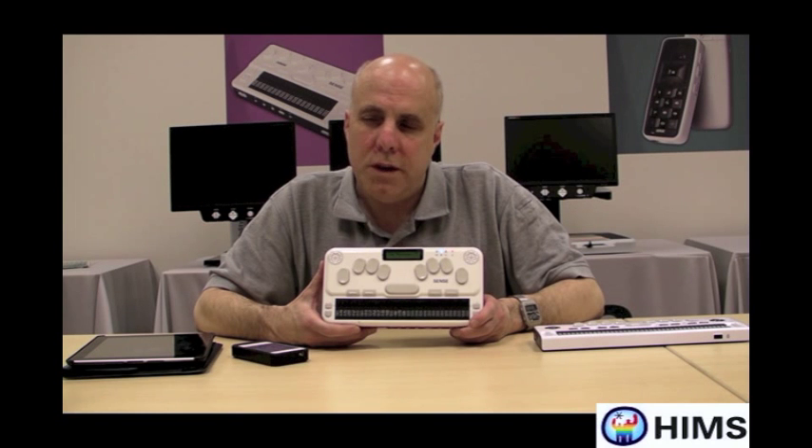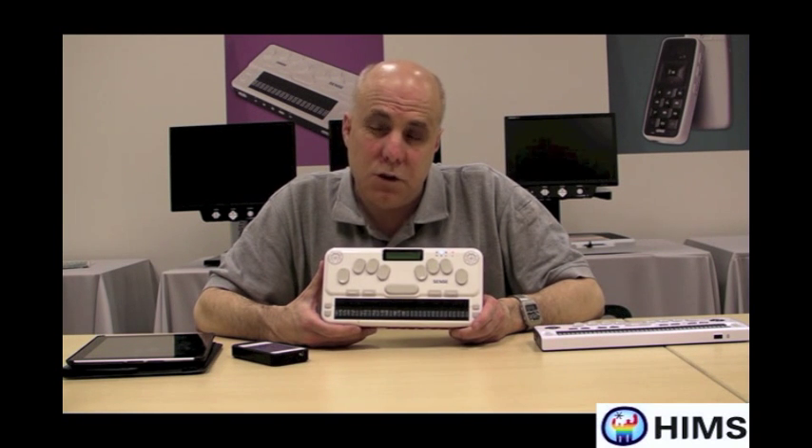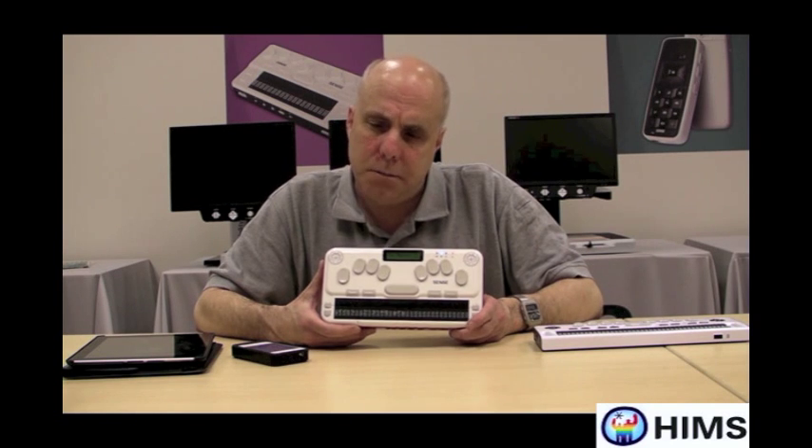First, though, we need to tell the iPhone that the BrailleSense U2 is available as a Braille display. So the first thing I'm going to do is make sure that the U2 is turned on, which it is. And I'm going to press the letter U for utilities. I'm then going to press the letter S for terminal screen reader mode — S as in Sam.